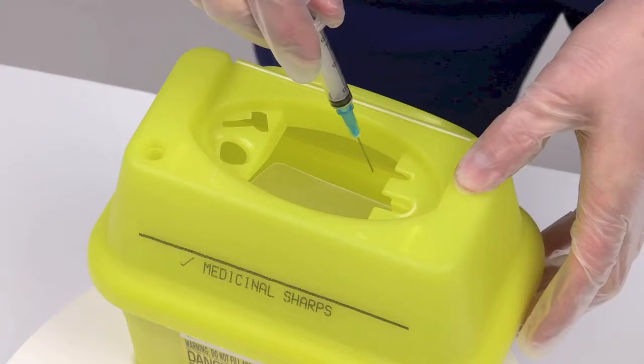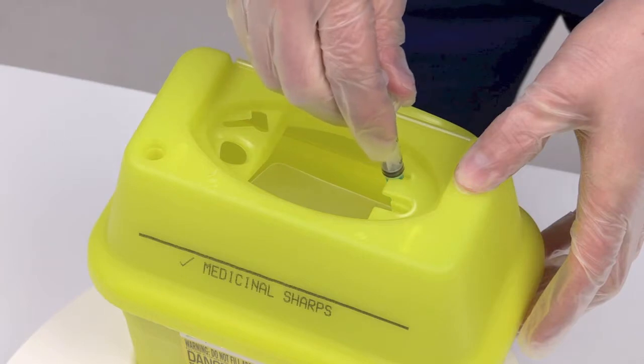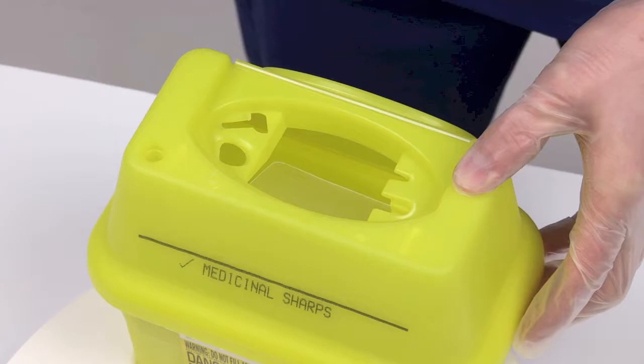Place the rim of the needle under the luer slip remover. Then, with the container held firmly, pull the syringe upwards until the needle slips off the syringe. Allow the needle to drop into the SharpSafe container.